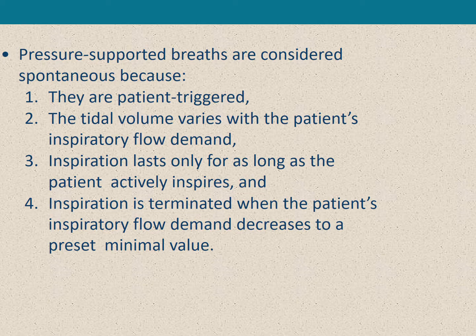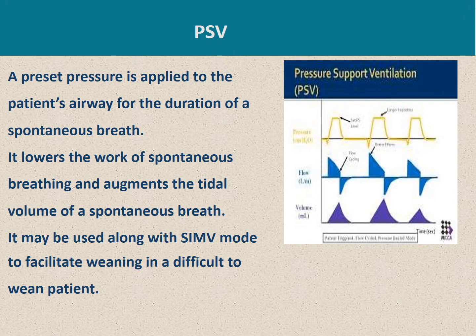Inspiration lasts only for as long as the patient actively inspires, and inspiration is terminated when the patient's inspiratory flow demand decreases to a preset minimal level. As you can see from the figure, a preset pressure is applied to the patient airway for the duration of the spontaneous breath. It lowers the work of spontaneous breathing and augments the tidal volume of the spontaneous breath. It also can be used with SIMV mode to facilitate weaning in difficult to wean patients.